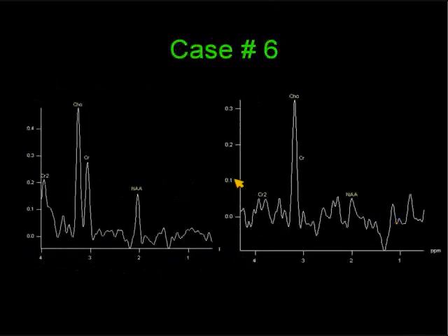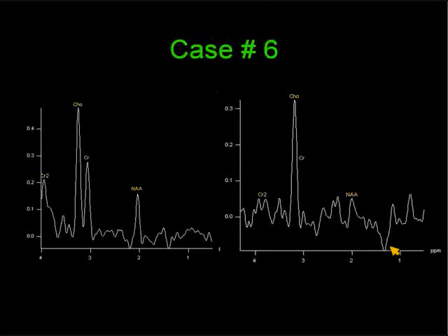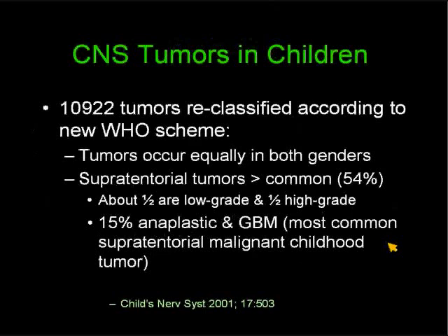Here we have the spectra of a low-grade glioma done with a long echo time. You see some elevation of the choline, about a 2-to-1 ratio with the creatine, and preservation of the N-acetyl aspartate. In malignant glioma, choline is highly elevated — at least 10-to-1 with respect to creatine — the N-acetyl aspartate has almost completely disappeared, and you start to get an inverted peak at about 1.3 parts per million, probably due to lactate and ischemia, signifying neovascularity.